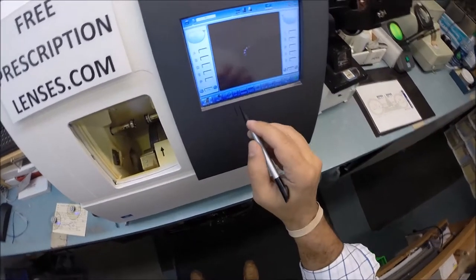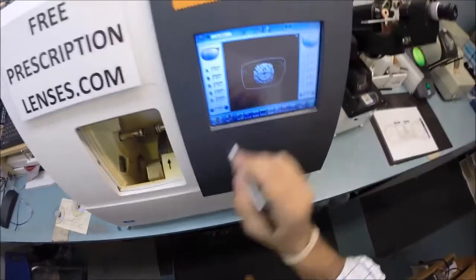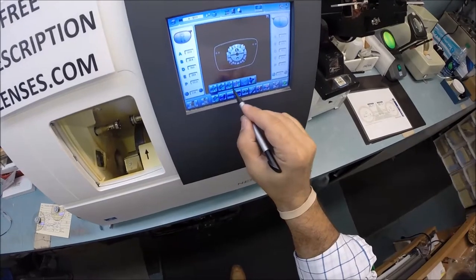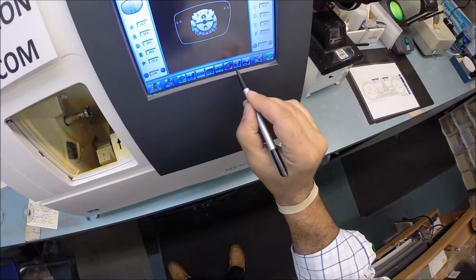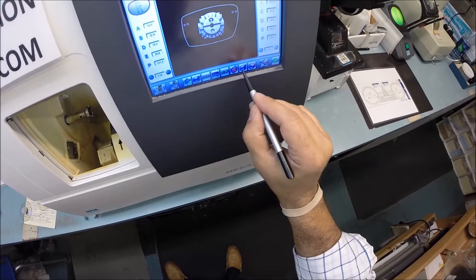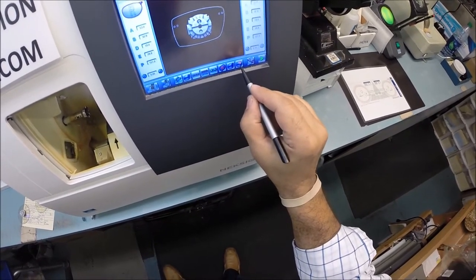Let me pull up the shape of the lens I'll be cutting today. You can see the two drill holes on either side. These are polycarbonate lenses — if they were plastic, high index plastic, or Trivex I would select that, but these are polycarbonate. This is the polish button — I do not want to put a polish on the lens. I am going to put a light safety bevel on the front convex surface of the lens and a heavier bevel on the rear concave surface of the lens.